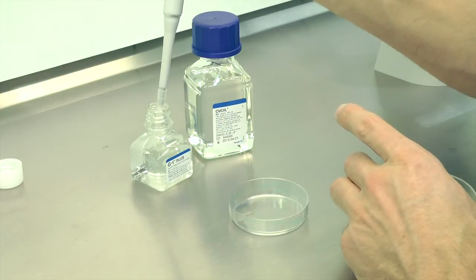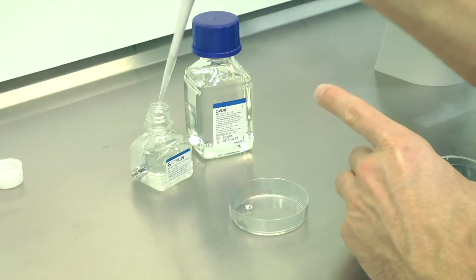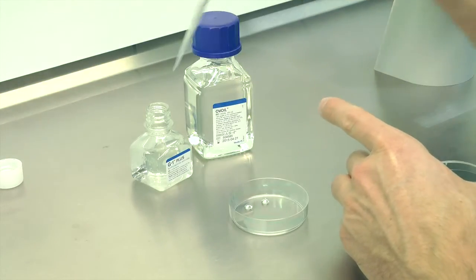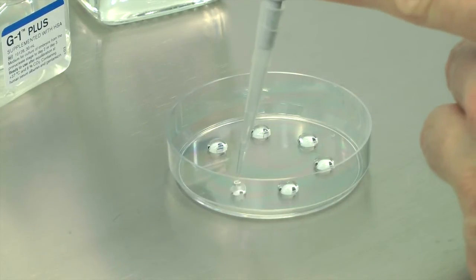I will now demonstrate the use of G1 and G2 for embryo culture. Prepare micro droplet dishes for the washing and culture of embryos with G1 Plus. Use 50 microliters of the G1 to prepare your micro droplet dishes. You can culture up to 5 embryos in each of these droplets.